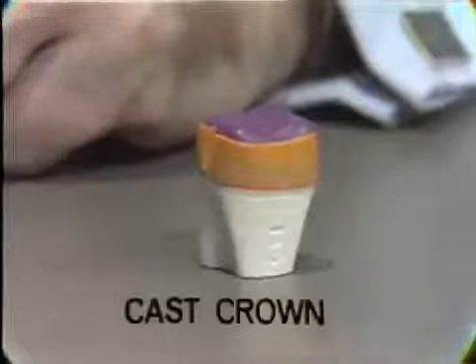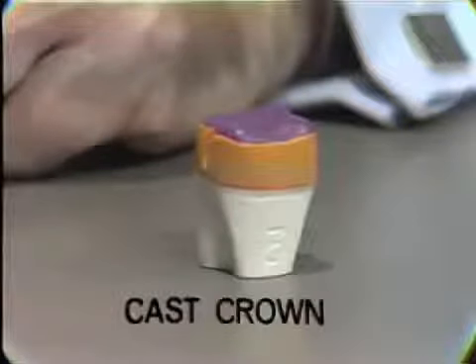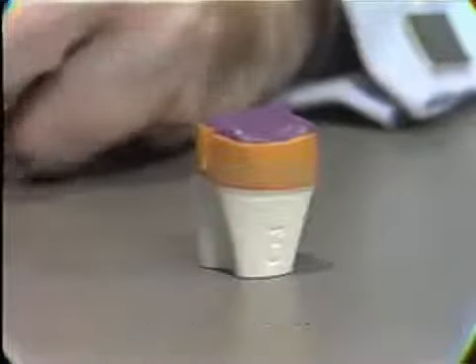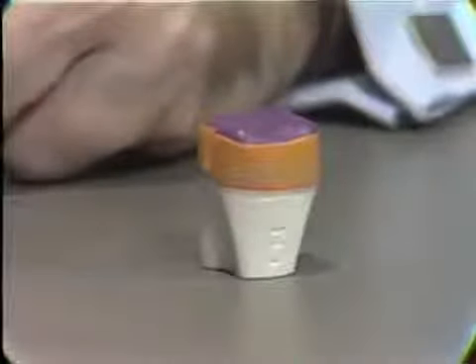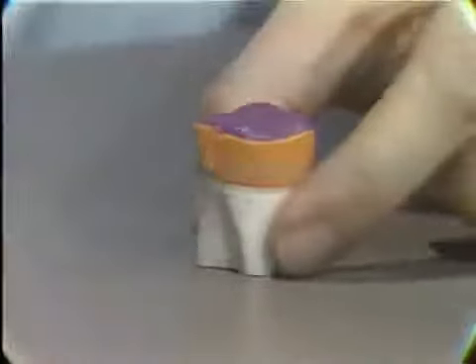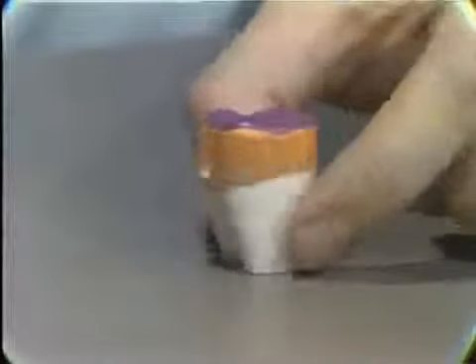The next modification of the complete crown, which we should perhaps take a look at, is the cast crown, which is used on posterior teeth. This is a complete crown preparation in which there is no aesthetic facing. The whole crown surface is in gold, and it is, of course, only used usually in the mandibular molar teeth, occasionally in the maxillary molar teeth. And you see such a preparation here on a mandibular molar tooth, which this is the buccal surface at which you're looking, and the proximal surface and the lingual surface.